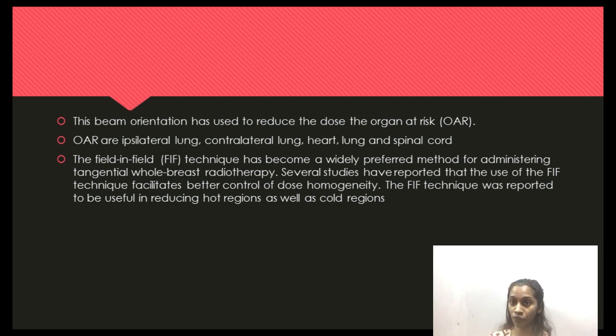This type of field technique is called the field-in-field technique, and this technique is a widely preferred method for administering tangential whole breast radiotherapy. Several studies have reported that the use of this field-in-field technique facilitates better control of dose homogeneity. The FIF technique was reported to be useful in reducing the hot region as well as the cold region.